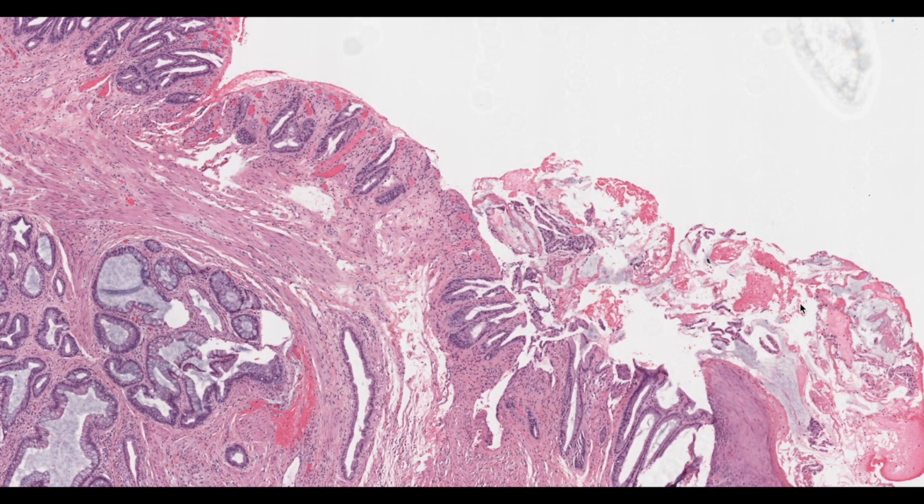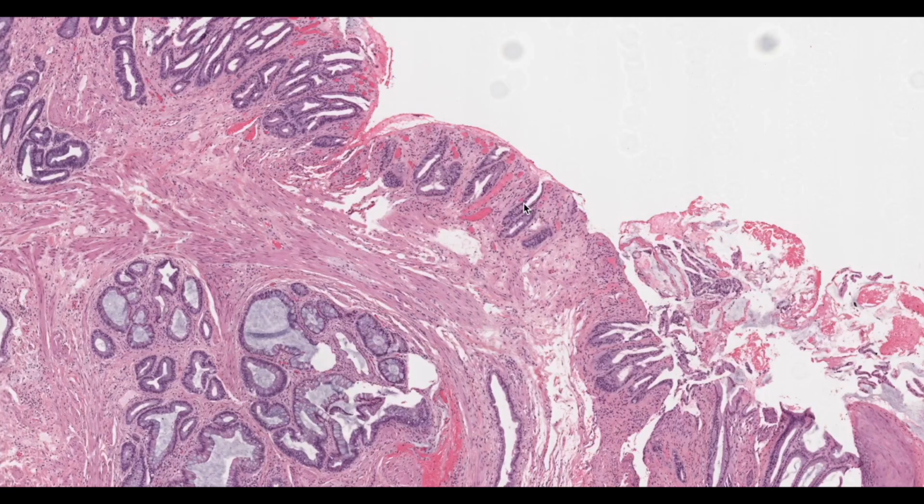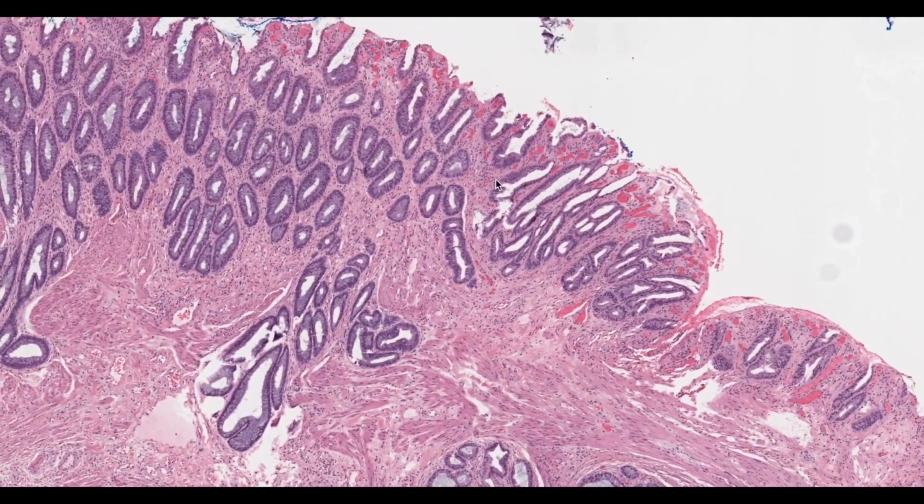Please wait. Do not jump into pseudomembranous colitis here. We'll definitely discuss that sometime soon, right? So you do have a pseudomembrane here. You do have an ulcer here. And below the ulcer, yes, you do have a good amount of capillaries.